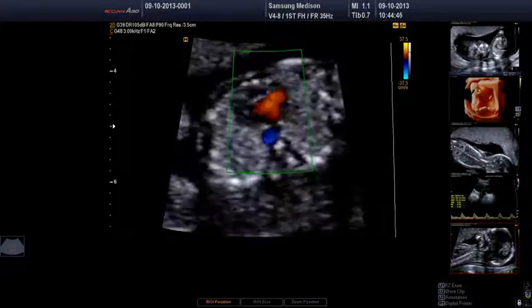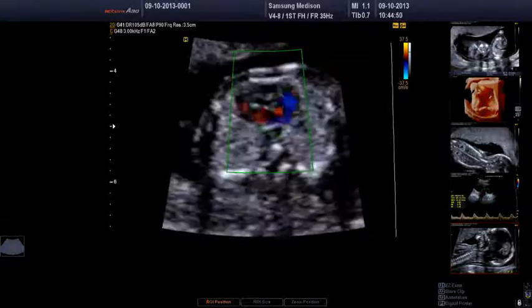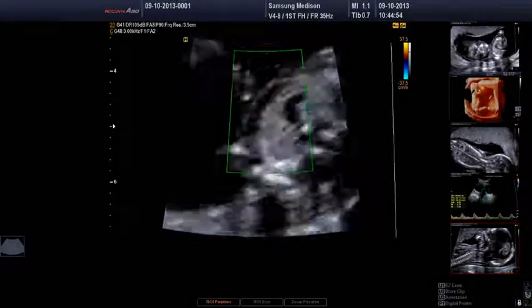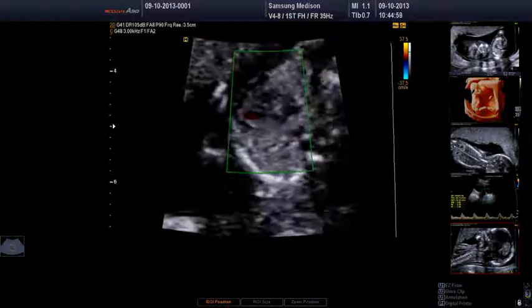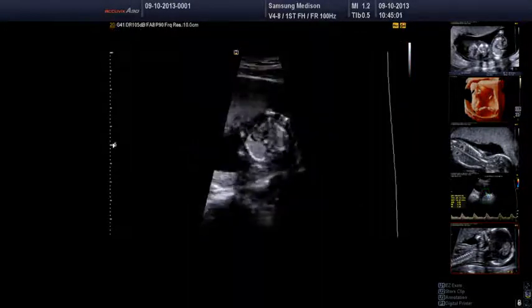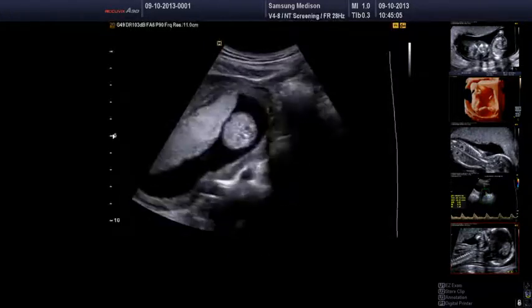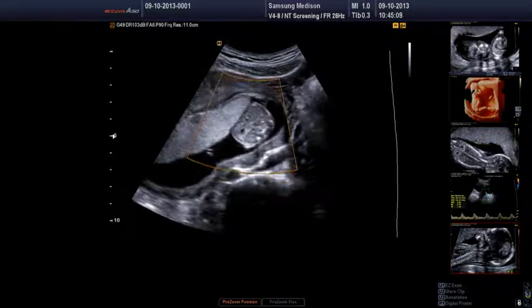So I think colour is very useful in the first trimester to help identify flow through chambers and also to make sure that you've got an appropriate crossover. And from a screening perspective, that would be all that I would do at this gestation. Let's carry on. So going back to the other setting, we can just continue to work our way down in this axial section.